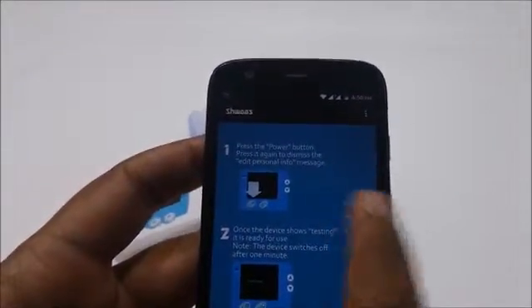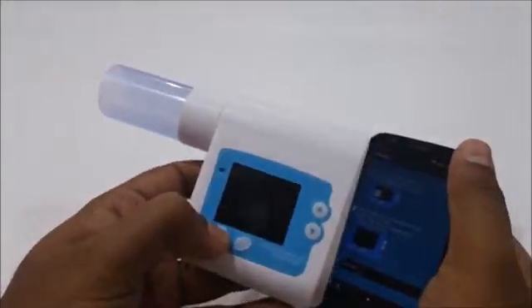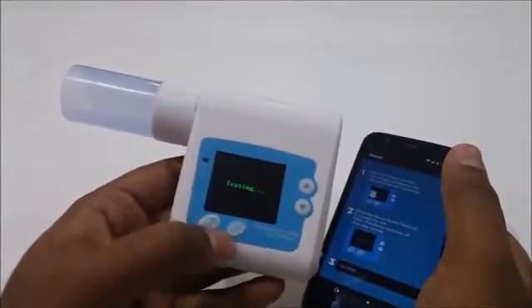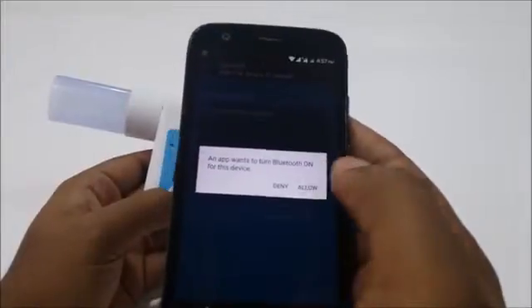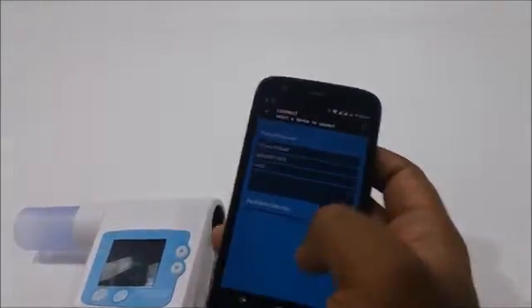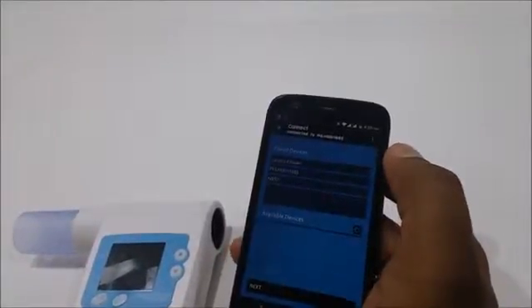Starting with the app first, you have a couple of simple help instructions. You first have to press the power on button for the device. Once you get past the first screen, you'll see a screen called Testing. You need to turn on Bluetooth on your phone — this allows the two devices to pair. The device appears on the already paired device list; otherwise, you'll have to scan and pair to a new device. I select the device and get the next button with a confirmation that I'm connected.